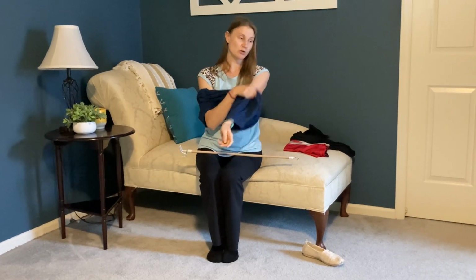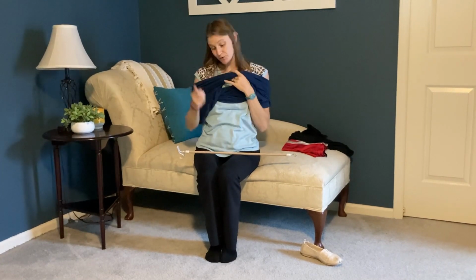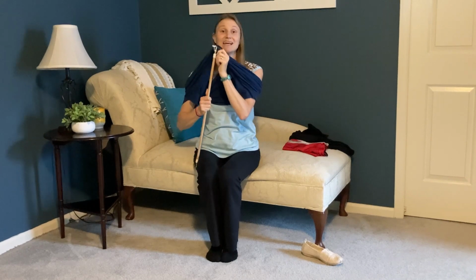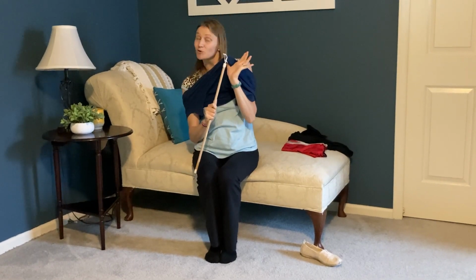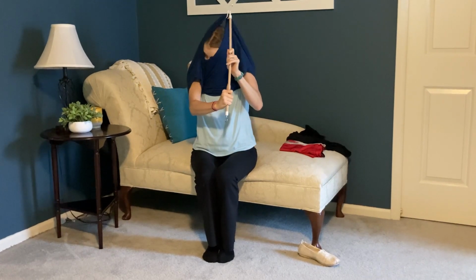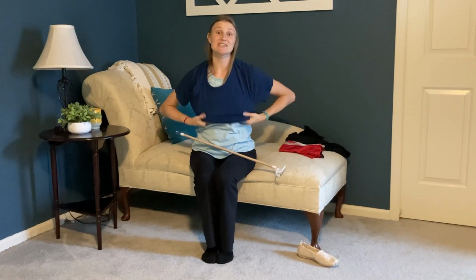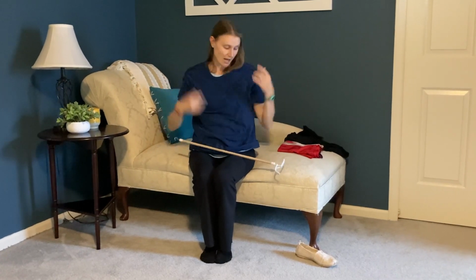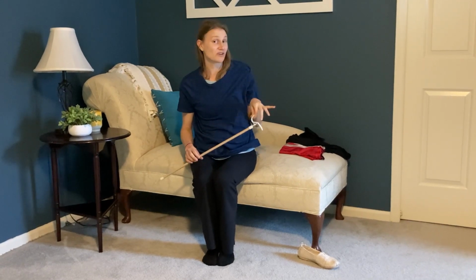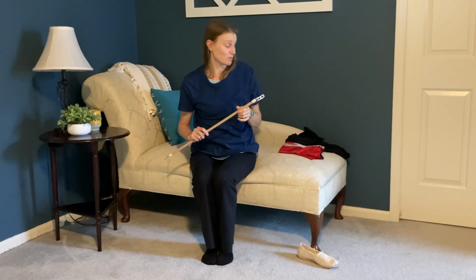So if you've got your shirt over your arms and you're trying to get it up over your head and you have limited reach for your shoulders, you can take this hook that's pointing upward, hook it onto the neckline of the shirt, being careful not to poke yourself in the eye or in the head, get it pointed to the side, and I can kind of take that dressing stick and get it up and over so that I can adjust this shirt down the back and pull it down. I will say the dressing stick does not have any components that are all that helpful for getting the shirt off, but certainly for getting it on, you can use it for that purpose.